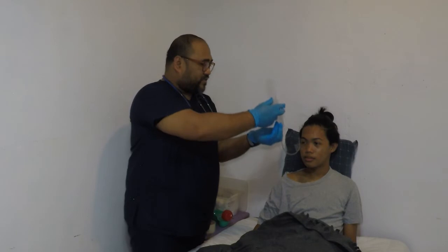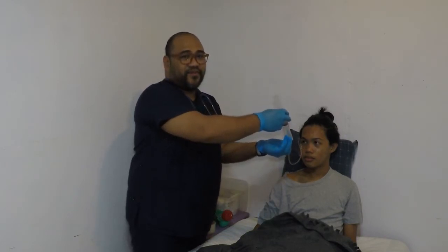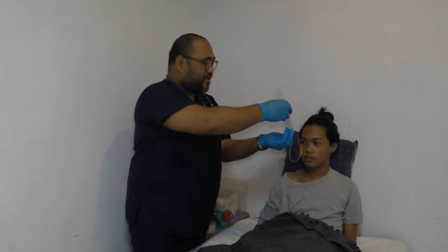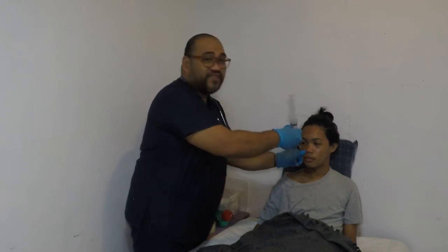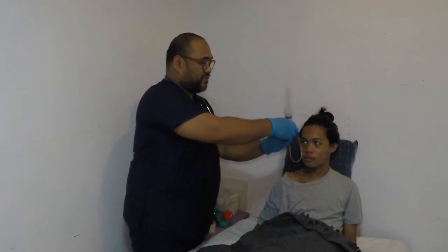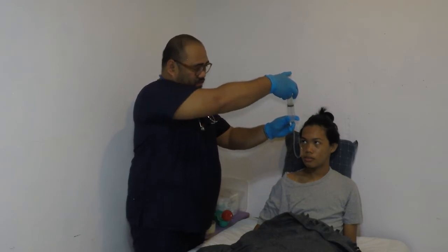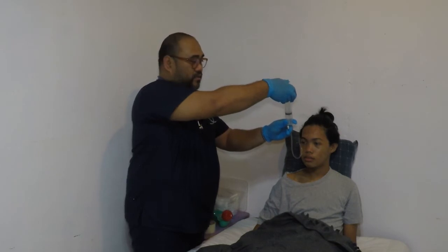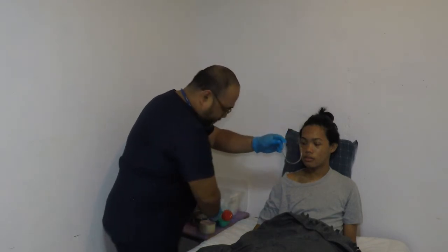Raise and lower the syringe to control the rate of the flow. Then add additional feeding if needed. So this is how we do it. So after raise, then push, until it is complete.